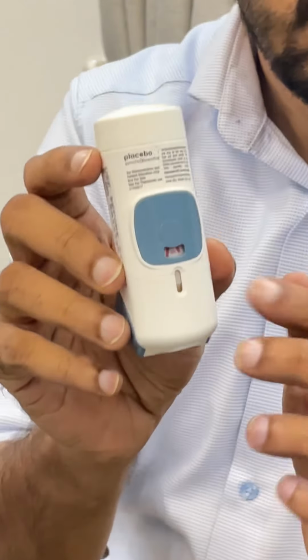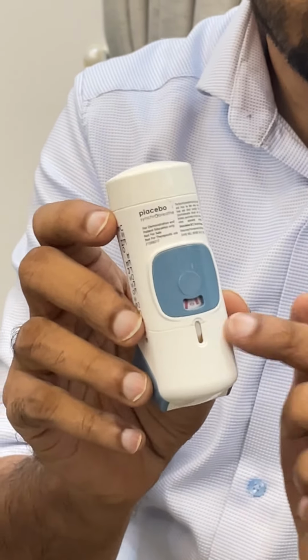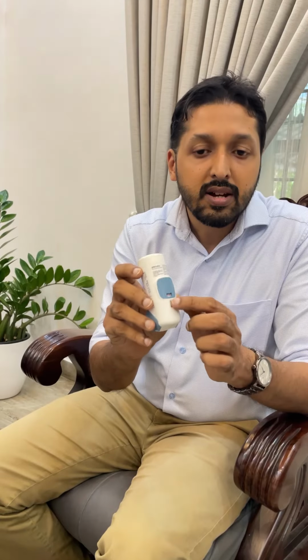The recent metered dose inhalers come along with a counter. So in this one, it's very easy and convenient for the patient to check how many doses are present. If it shows 0, it means this canister is empty.